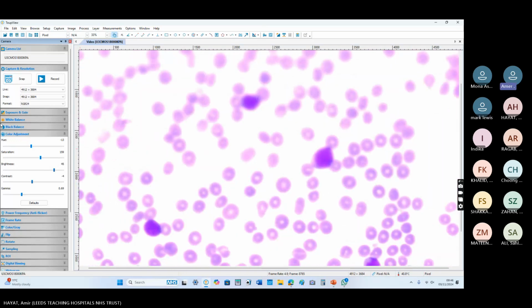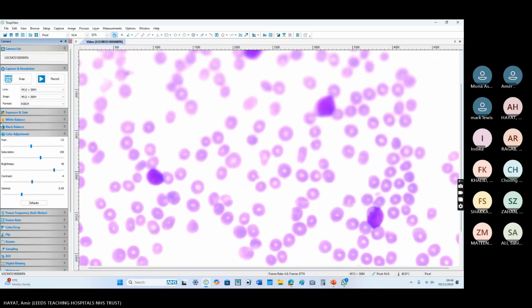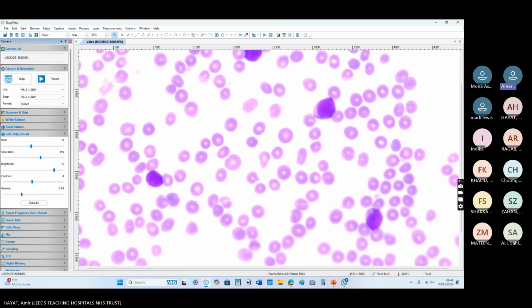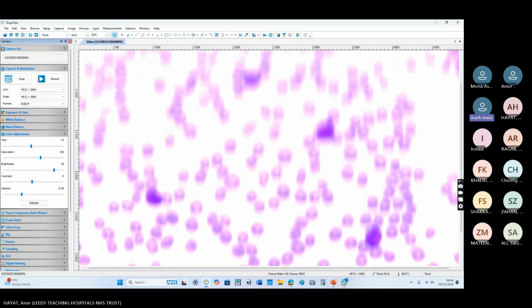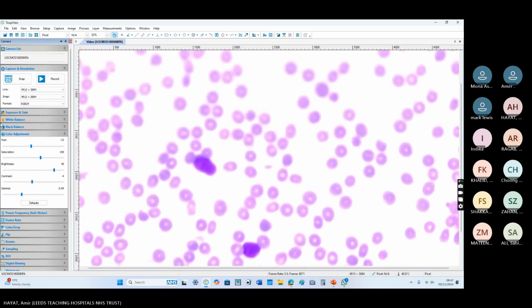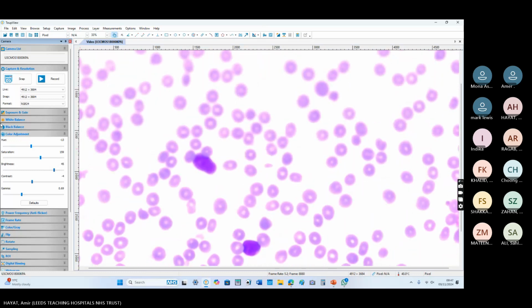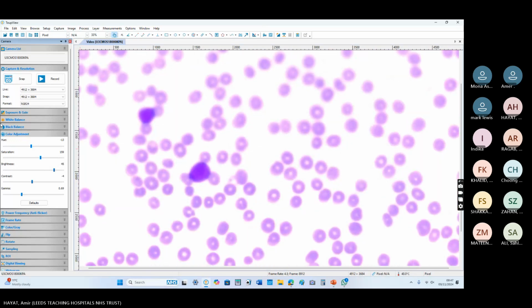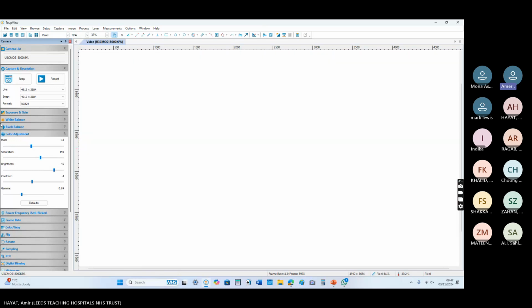When we looked at this slide first, this is a last week slide, we thought that there is a bit of granulation. They are myeloid, but we got a different result on flow. Okay. Two more. Make it high power.